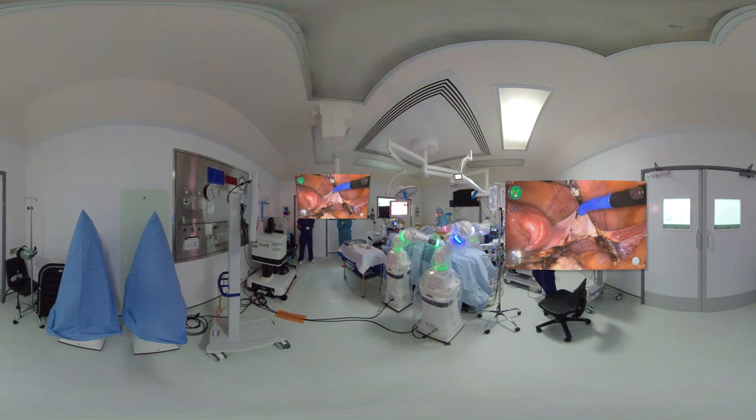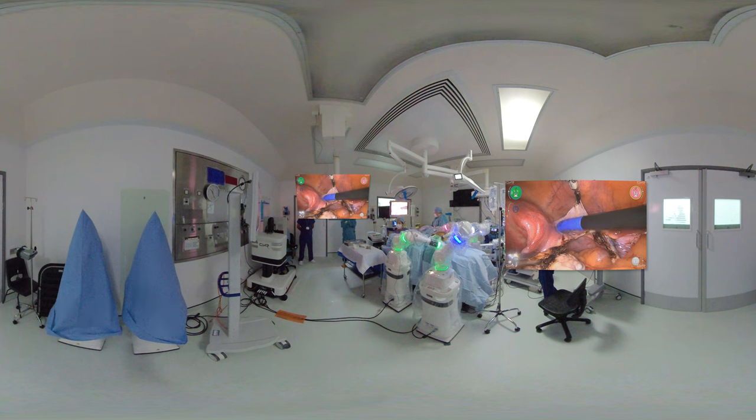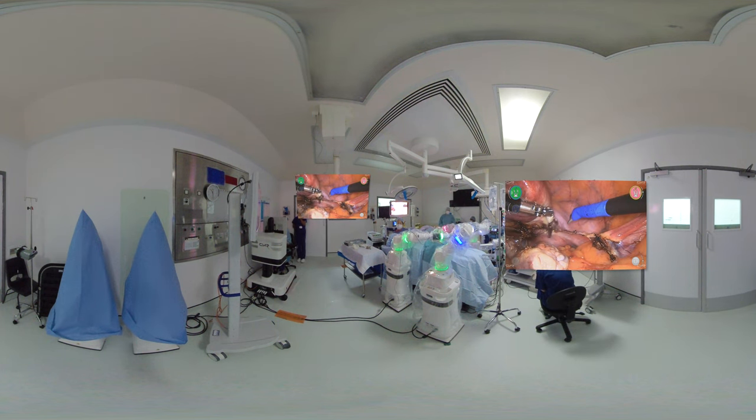We are separating the anterior fold of the broad ligament here and we're going to push the bladder down. This lady has had a previous cesarean section and is having surgery for endometrial cancer. There are some adhesions on the front near the bladder but we have managed to push it down successfully. We are now coagulating the uterine vessels on the right hand side and once we are relatively happy that they are coagulated, we're going to start cutting them using the monopolar scissors. We will repeat the same procedure shortly on the left hand side as well.